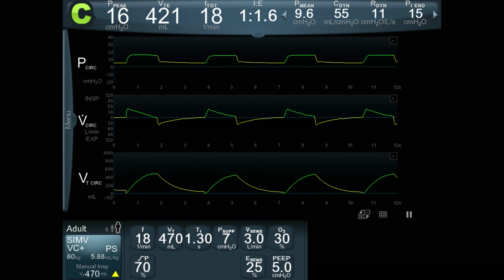This is one of those versions that you will see on your ventilator. This is volume guaranteed pressure control in SIMV. And I've said to colleagues who I work with, if they want to use PRVC, SIMV, or this particular mode, if they can actually explain to me what is happening from breath to breath, then they can use it. But as really nobody's quite sure what's going on with the patient from breath to breath in this mode, I think you're much better off just using the assist control version of it.